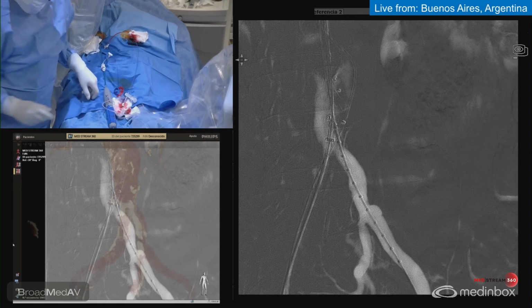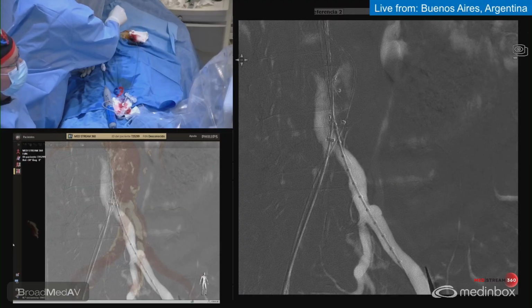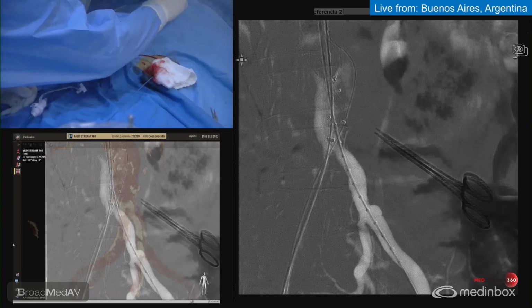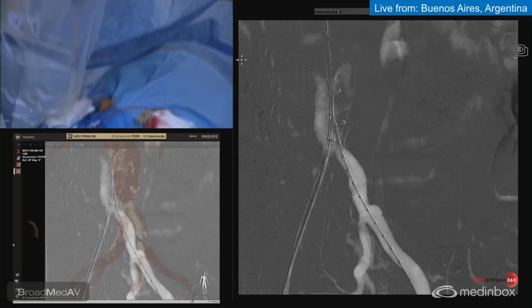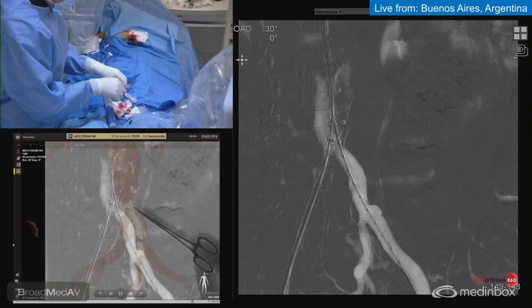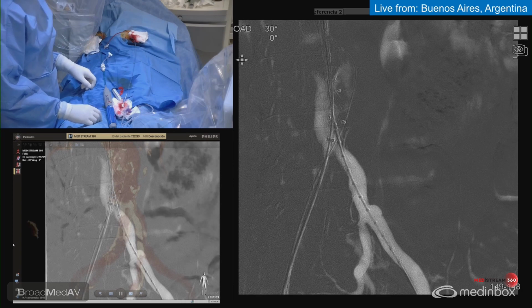What we are trying to do with Gustavo is to measure the distance from the device, which is here. And then we have 1, 2, 3, 4, 5, 7 centimeters. Which are the disadvantages of this device? We don't know exactly so far, so many, because it's a very new device for us.